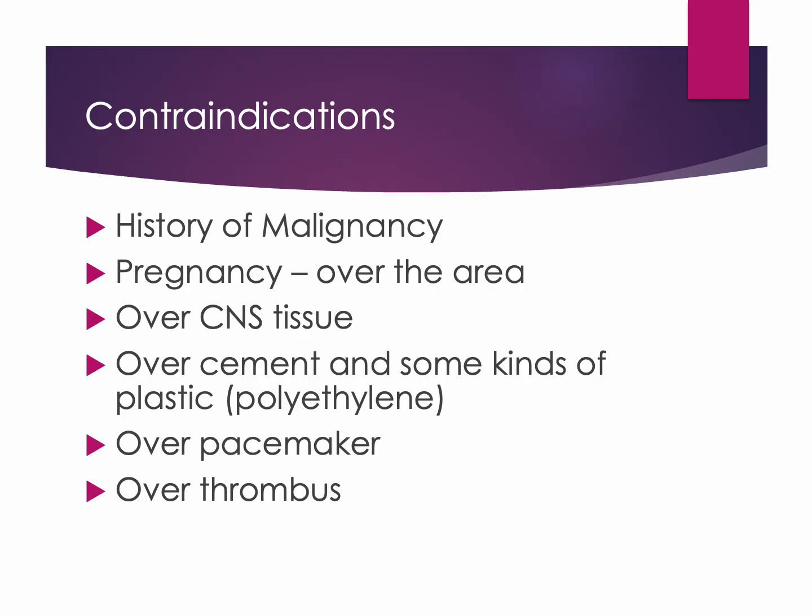Thermal ultrasound is also contraindicated over a pregnant uterus. Ultrasound waves can create tissue heating, and there are concerns about potential effects on fetal development. While diagnostic ultrasound used in imaging is very different, therapeutic ultrasound should not be applied over the abdomen, low back, or pelvic region during pregnancy.